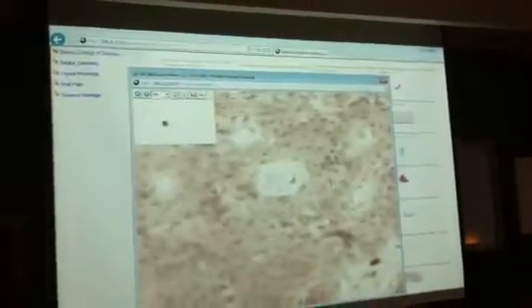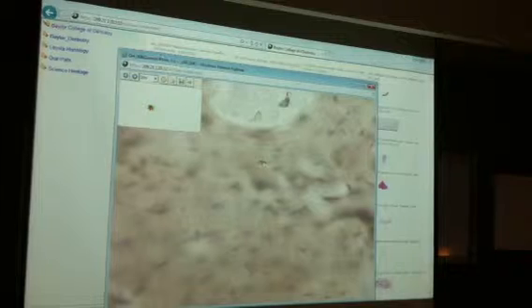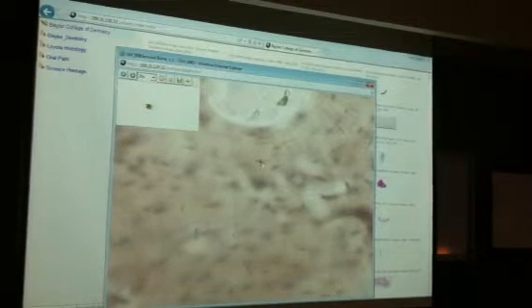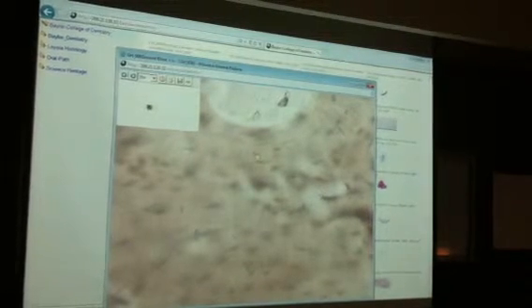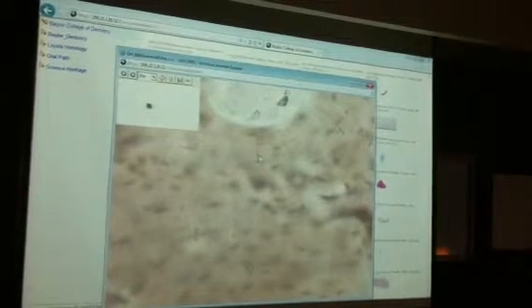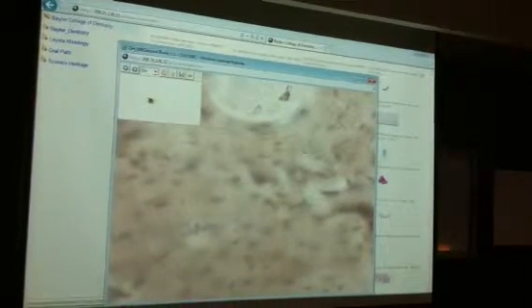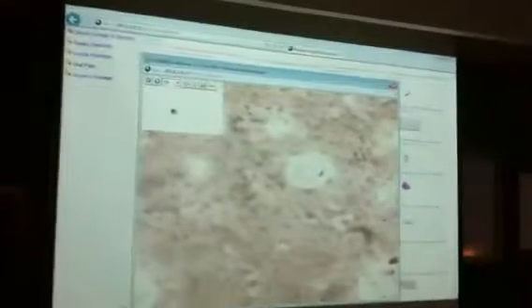Everybody at this point knows when I look at these things, maybe I won't go that high, that the blackened structures here are your lacunae. What cell would reside inside of there would be an osteocyte. All the little fibers radiating out from it would be your canaliculi. What would you find inside the canaliculi? Philopodia, that sort of thing. So really, on a practical exam, it's going to be about, is it a line going from here to here?